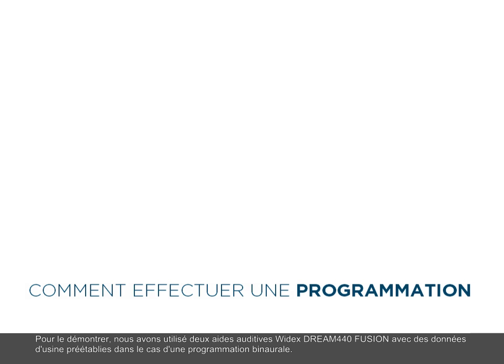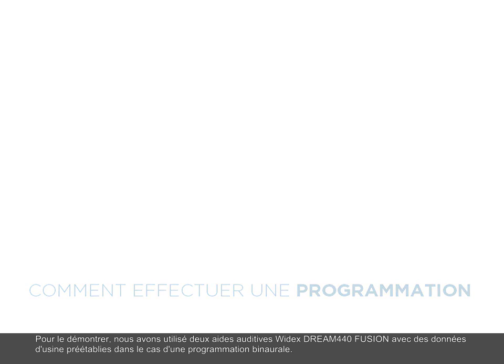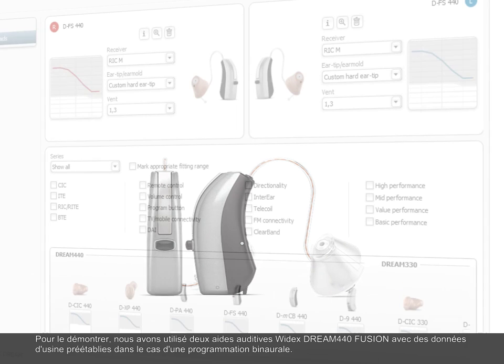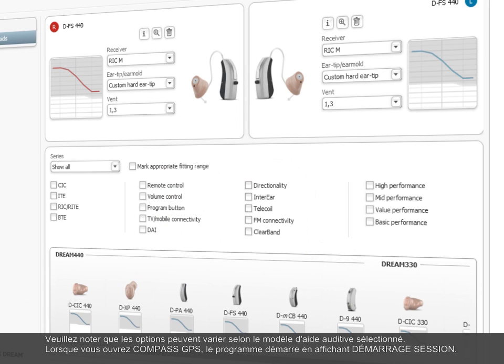For this demonstration we have used two Widex Dream 440 Fusion hearing aids with factory preset data in a binaural fitting situation. Please note that options may vary depending on the hearing aid model selection.